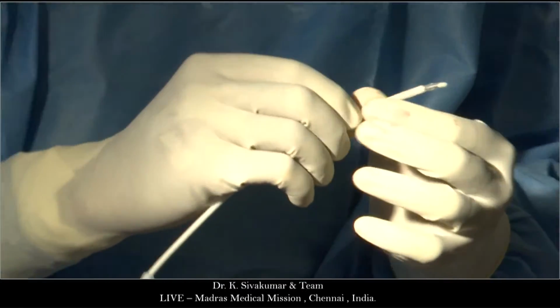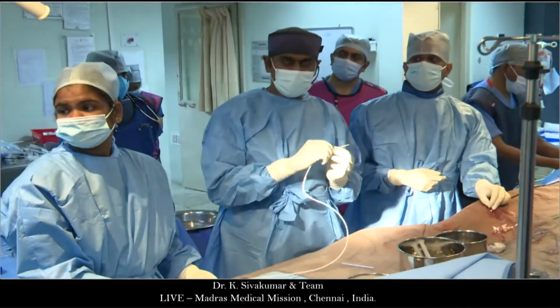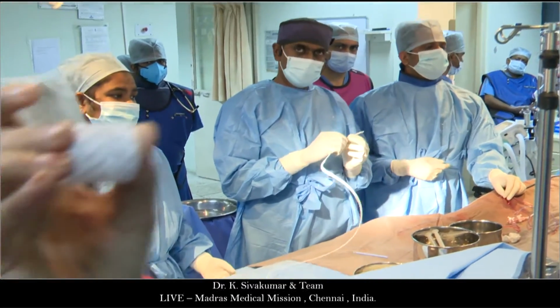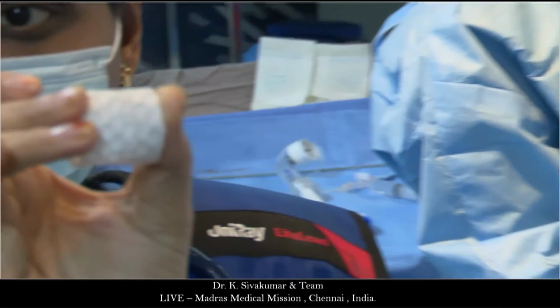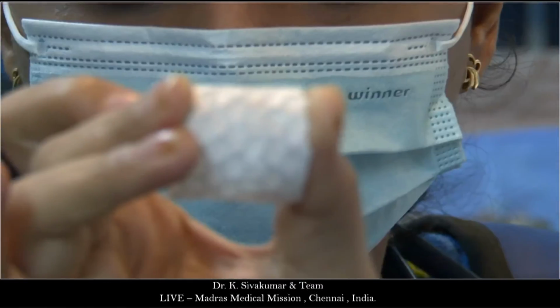My colleague Dr. Fareen Qureshi will show you a bench tested stent. She will show you now. Show it. No, not so close. So this is the bench tested 25 millimeter. It's totally embedded.